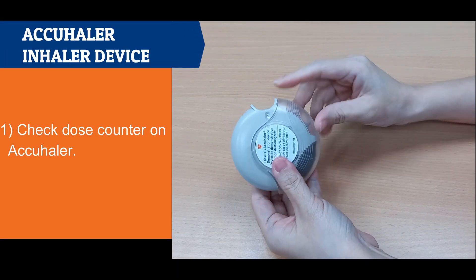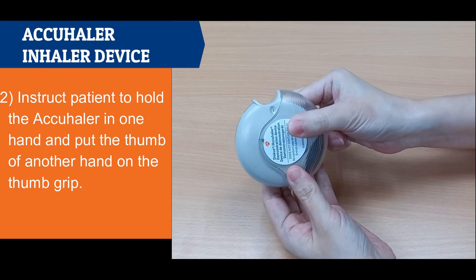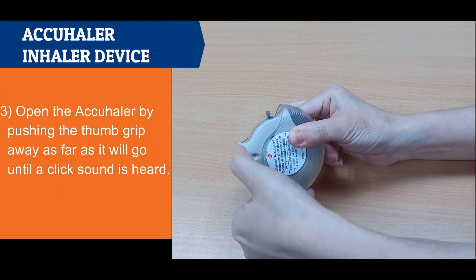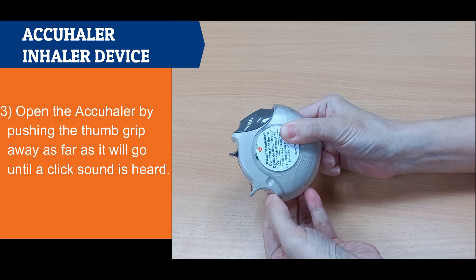Accuhaler Inhaler Device. Check the dose counter on the accuhaler. Instruct the patient to hold the accuhaler in one hand and put the thumb of the other hand on the thumb grip. Open the accuhaler by pushing the thumb grip away as far as it will go until a click sound is heard.